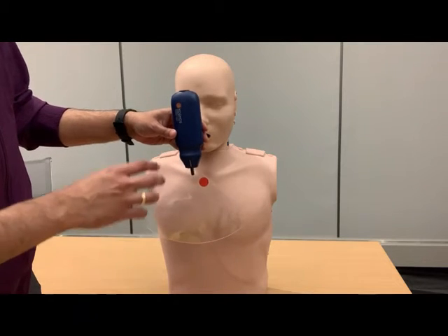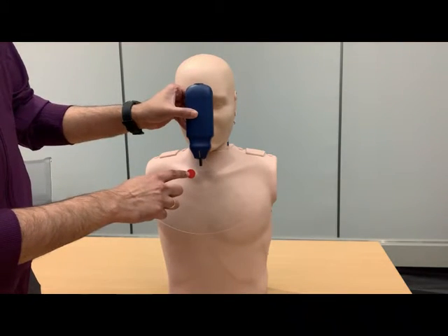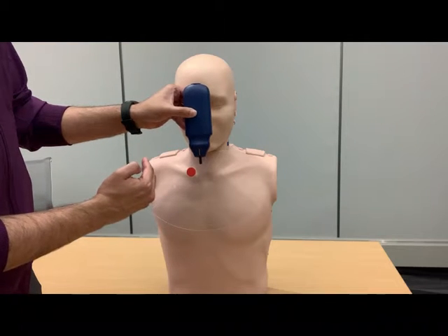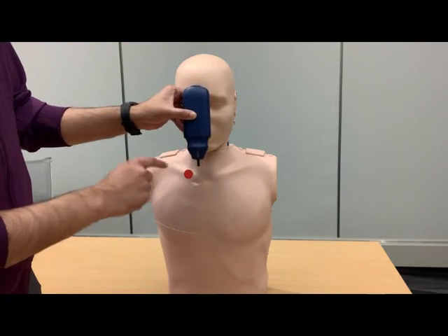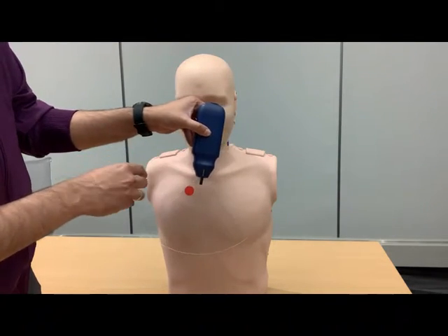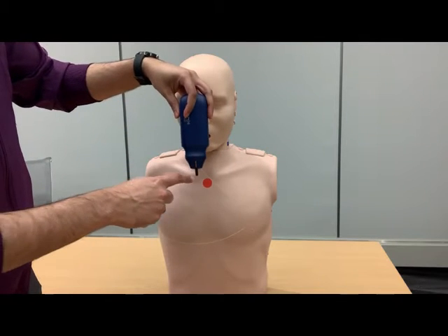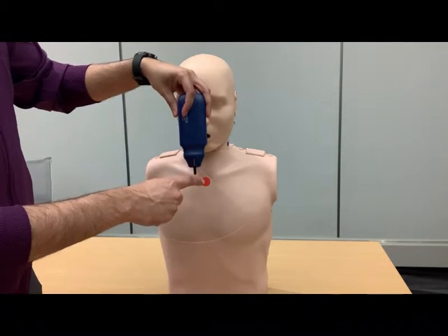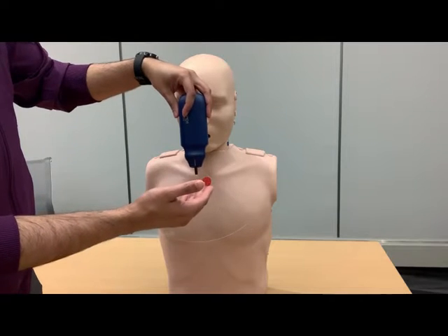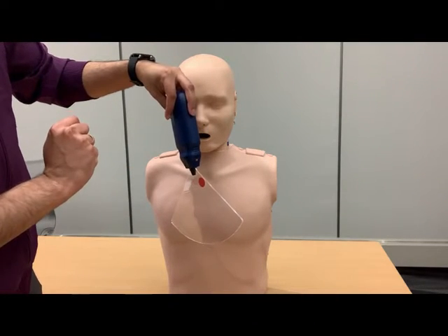This principle won't change whether you are in abdomen preset or cardiac preset. What changes is that in the abdomen preset, the orientation marker on the screen is towards your left side, but it still corresponds to the probe orientation marker. On the other hand, when you choose the cardiac preset, this orientation marker goes towards the right side of the screen — but it still corresponds to the probe orientation marker.